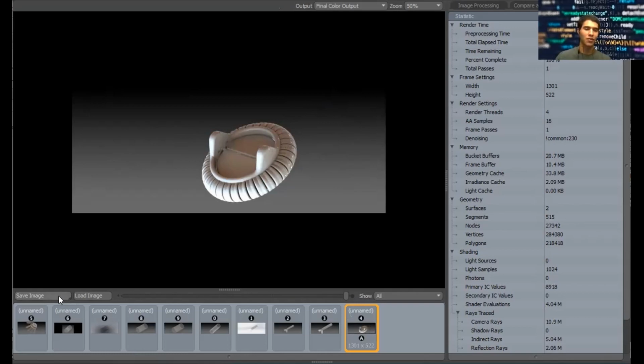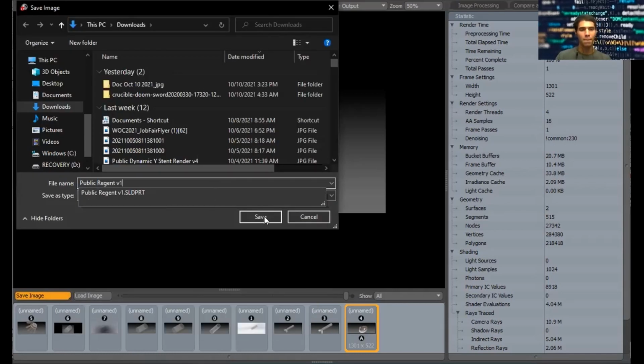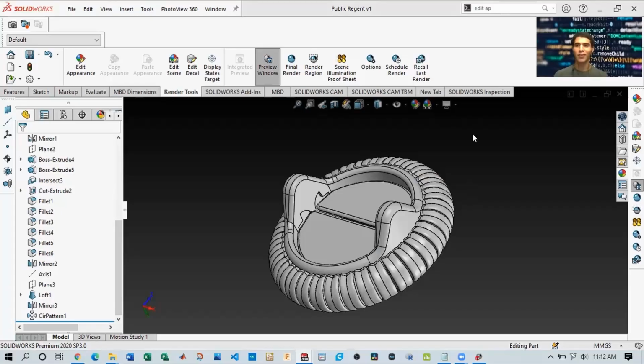By the end of it, you want to save your render. So save image. And you decide, okay, where you want to save it to. Give it a nice name. Public Regent V1 render. So that was pretty much the end of it. I hope you guys learned some things, and now you can go model a Regent mechanical heart valve.